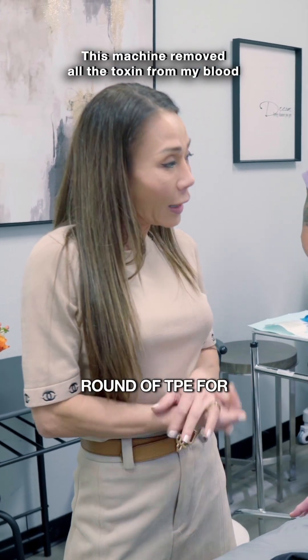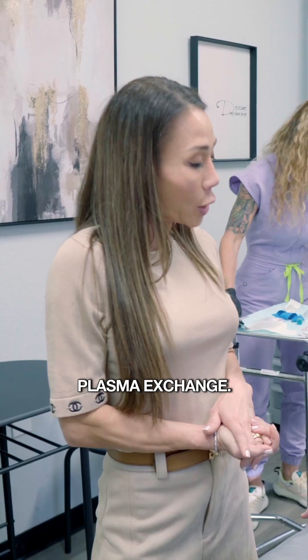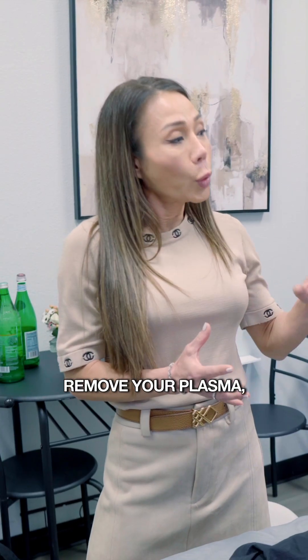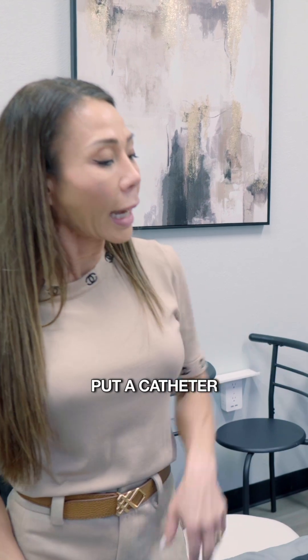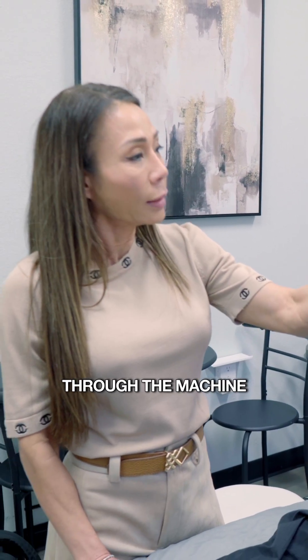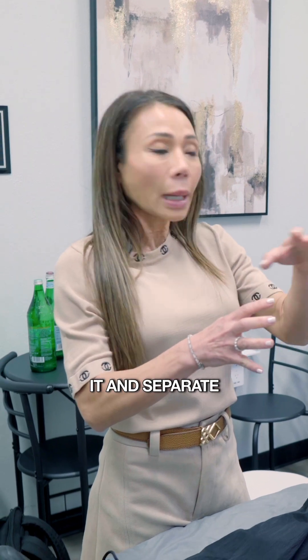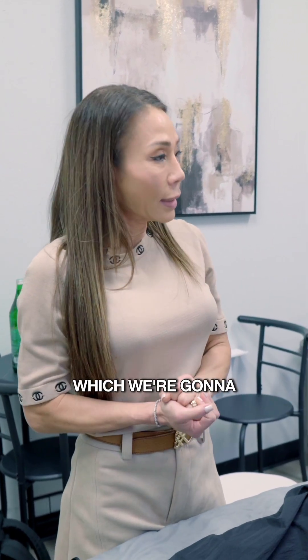We are doing another round of TPE for you, which is therapeutic plasma exchange. So we're going to remove your plasma using this machine. We're going to put a catheter in your arm and the machine will take your blood through the machine, spin it and separate the plasma out, and that will be collected in that bowl there, which we're going to see.